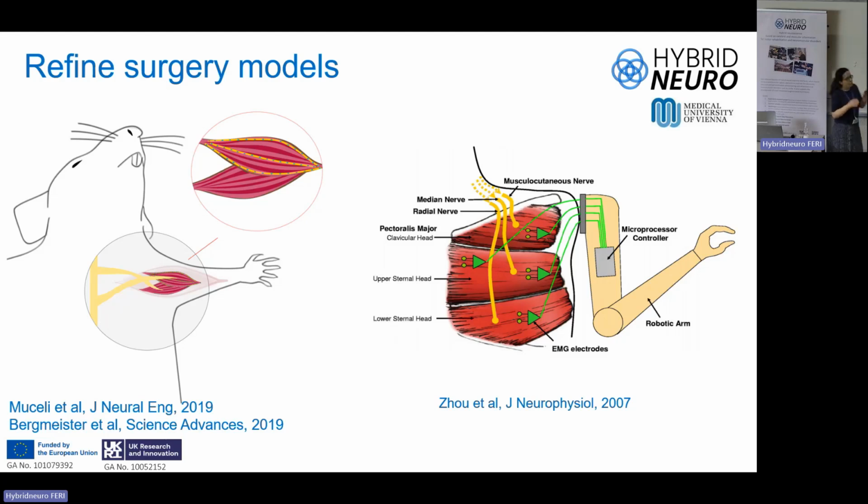So far, we have discussed surface electrodes and intramuscular electrodes. This recording was neither surface nor intramuscular. What our colleagues did was open the skin and place the electrode directly on top of the muscle. We refer to this recording as epimysial. So not on top of the skin, not within the muscle, but directly on top of the muscle. And the electrodes were aligned with the muscle fibers.